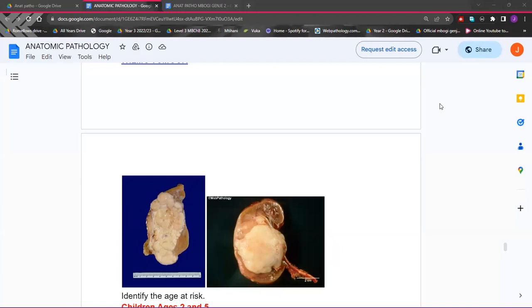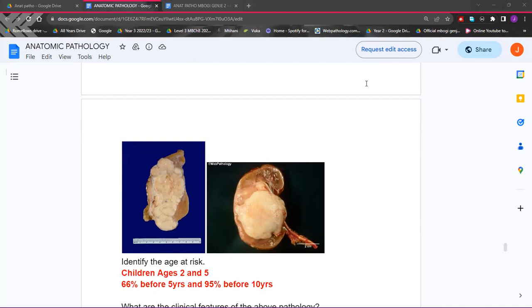Do we see areas of hemorrhaging or areas of necrosis? There is extensive invasion. Yes, exactly. So it is invading the adjacent tissues. I agree. It's a good response. Especially for the first one. The second one, it's well circumscribed. But the first one, probably a little. But there's sort of conflict or opposing views when you say something is solid and something is invasive. You know, not solid, but well circumscribed. So maybe we can go with well circumscribed for this one. But for A, you might argue and probably get the first image.